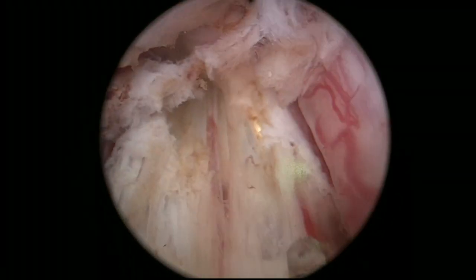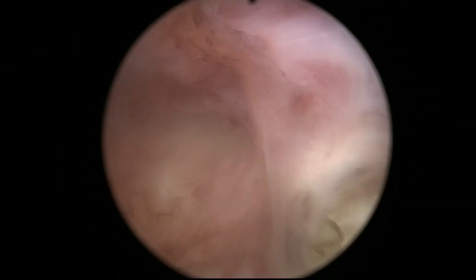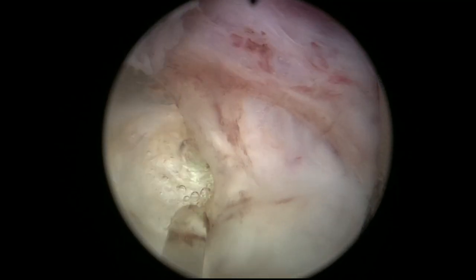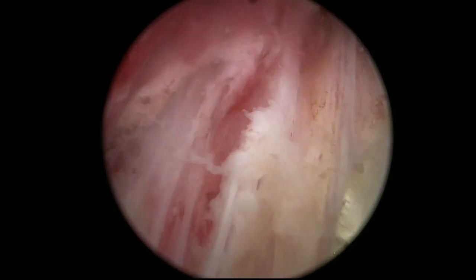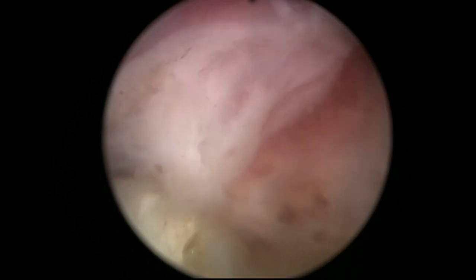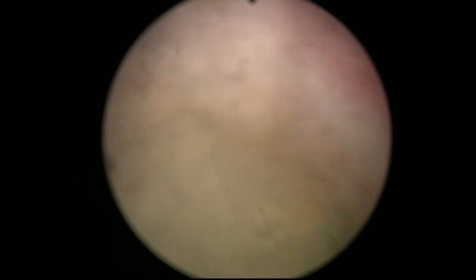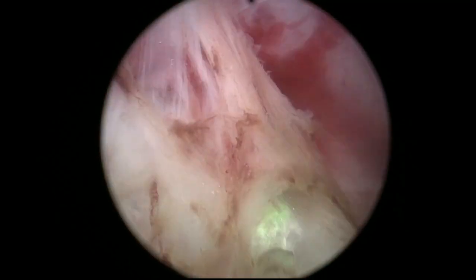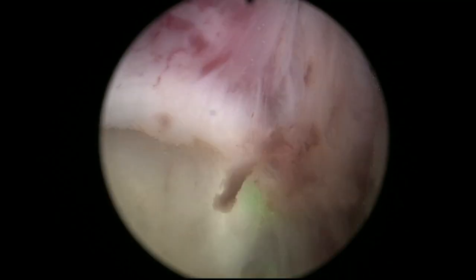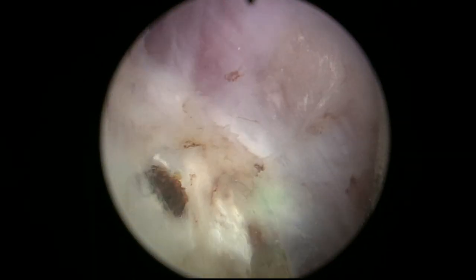The advantage here is an amazingly good hemostasis. I got the question the other day: which laser do you think is better to learn? Holmium would probably open the plane a little bit easier, but in this case, following the plane is a little bit more difficult. On the other hand, in general, I think the hemostasis is really excellent — maybe even better than Moses or Virtual Basket, although it's difficult to say.